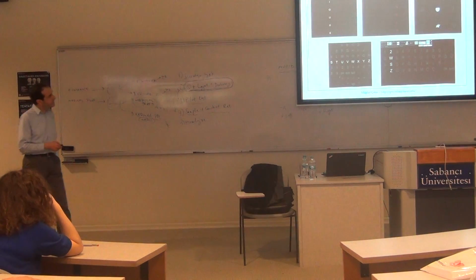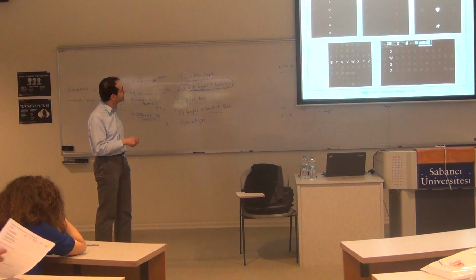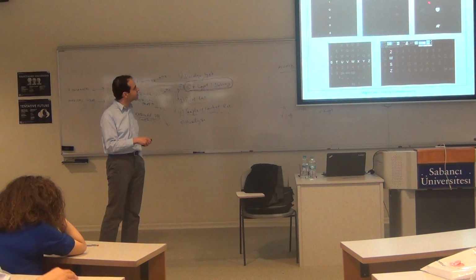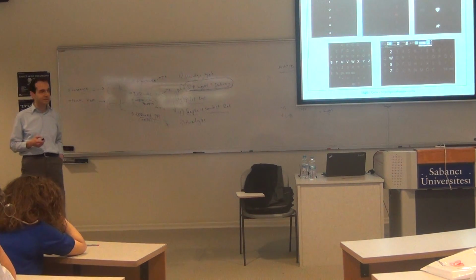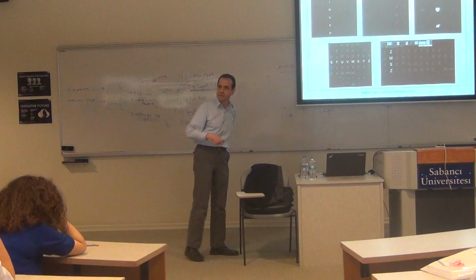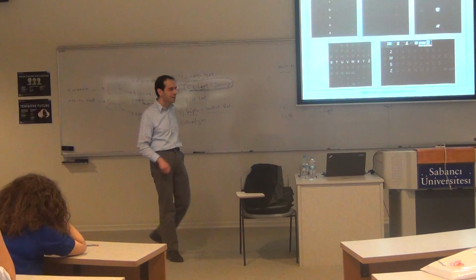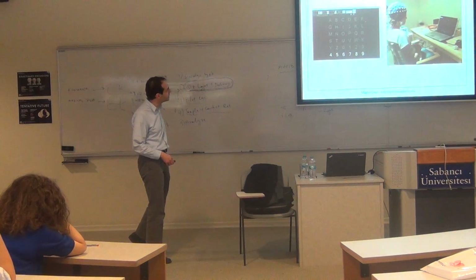Okay, so in our lab we have developed a P300 spelling interface. We can type letters, you can type them using color, etc. You can do other things such as call an ambulance or whatever commands you want to issue. This is just a tool to make decisions. You can also make a hierarchical menu. First you declare one thing, and then based on the result you may move into a next menu, etc. You can have a circular interface, you can have a keyboard type interface, so you can do all of those things. So this is the interface side.